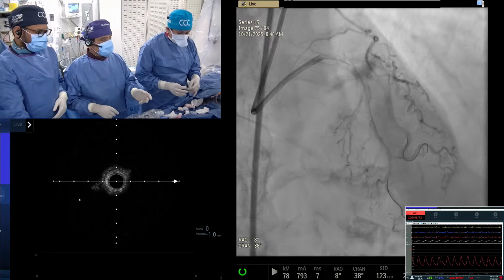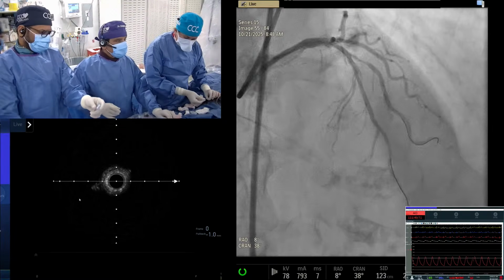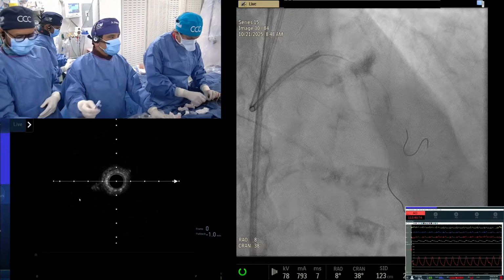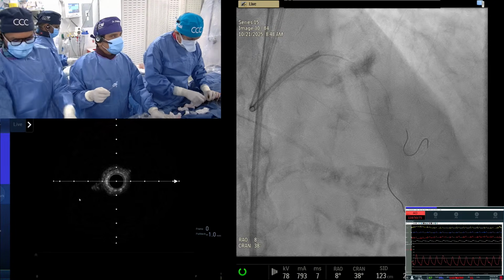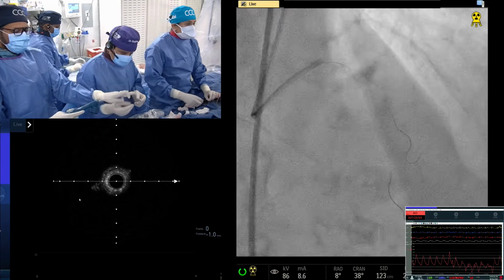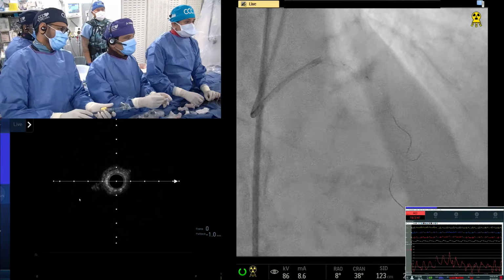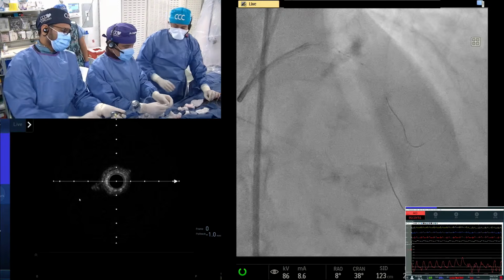We have had at least 3 live cases where you can see deep intimal dissection as well as cuts, which I always worry about. When you stent it, there's a risk of perforation. So you have to know exactly the size and how many pulses you can give.